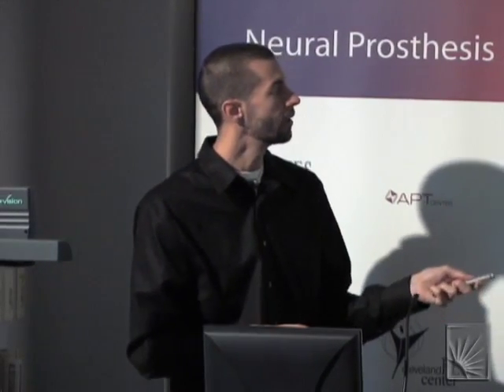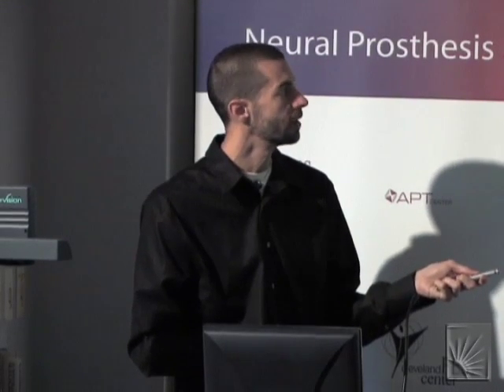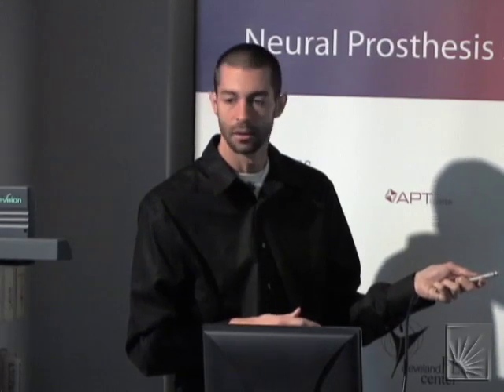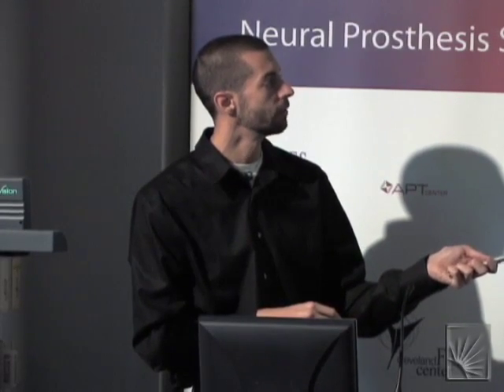They have a consistent relationship between where the subthalamic nucleus is and the zona incerta, as a name that's used, or the lenticular fasciculus area. They have a known relationship with each other, at least in these generic brain data or brain atlases that are available out there. So you would use the information that you can get easily on a relative scale, STN neural recordings, but you're really using it to help constrain where the relative position is here. Does that make sense? Yes.